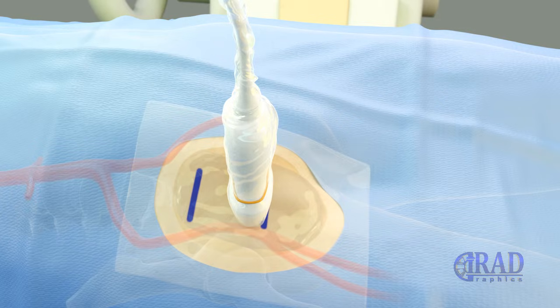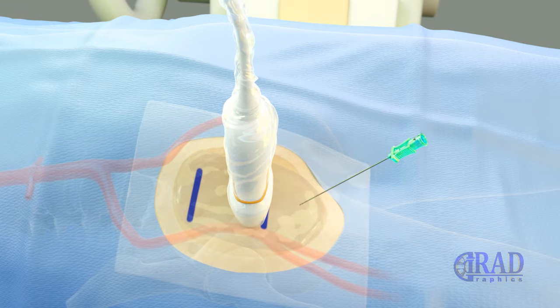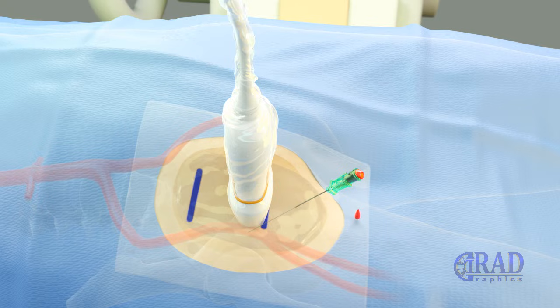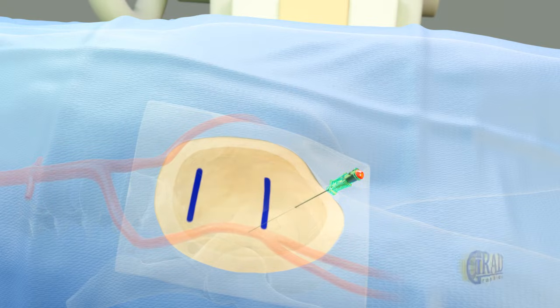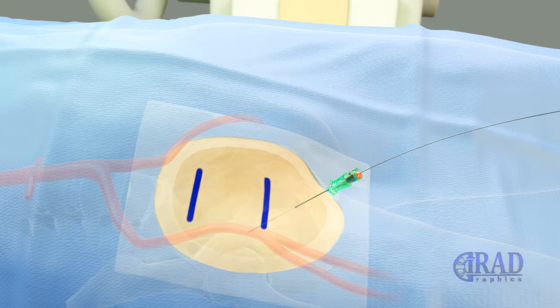Then, the right common femoral artery is accessed under ultrasound guidance using a micropuncture needle. Once blood return is noted, a microwire is advanced through the needle into the right common femoral artery.